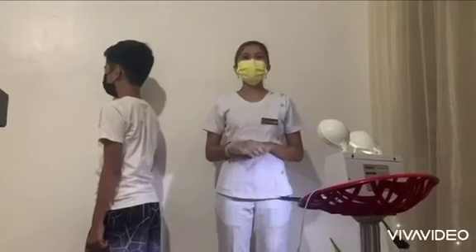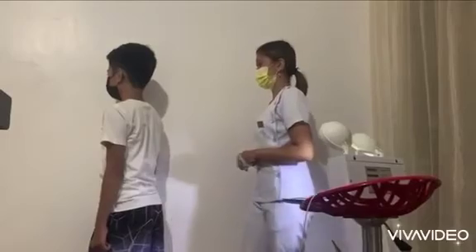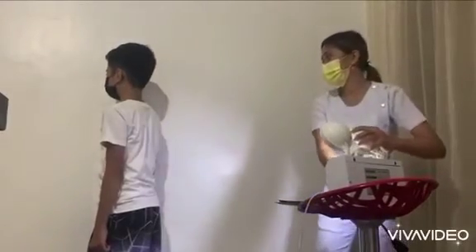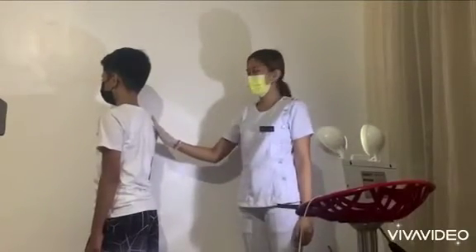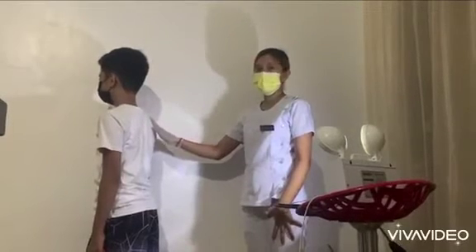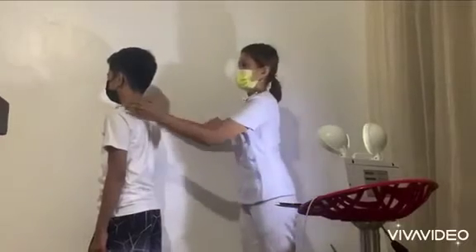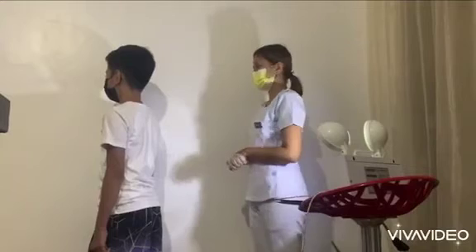What we have to do to the patient is get the body of the scapula in a true lateral. That means you're going to look at and touch your patient and turn their body about 45 to 60 degrees.